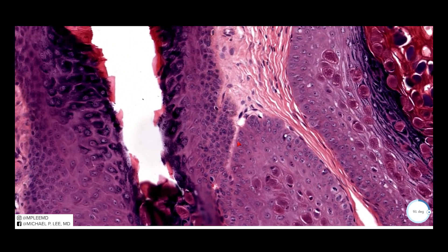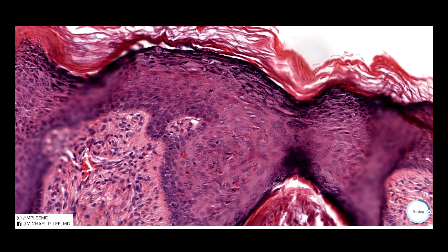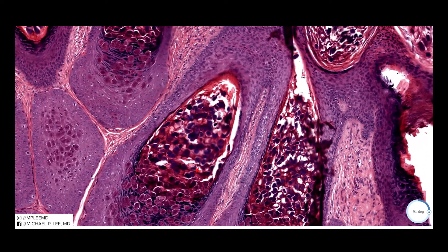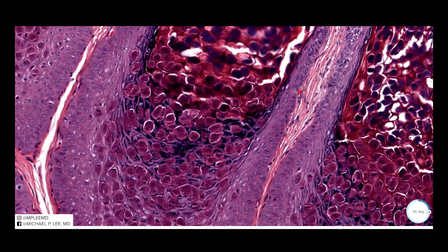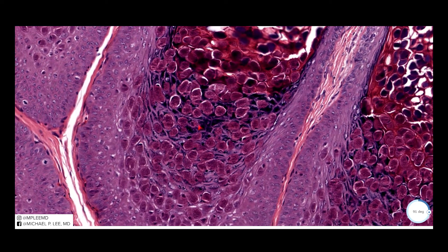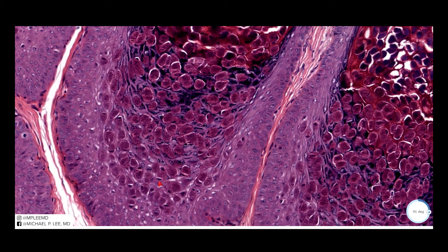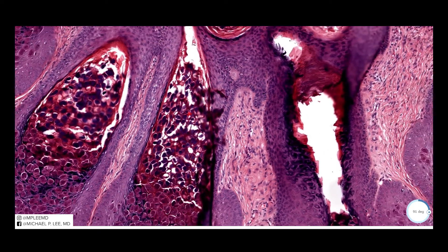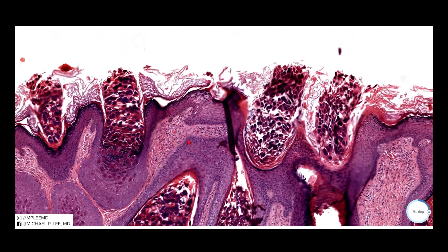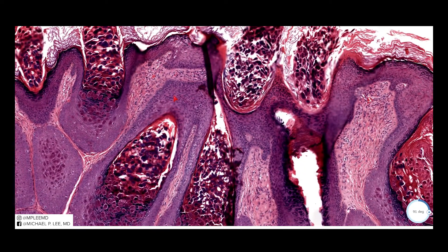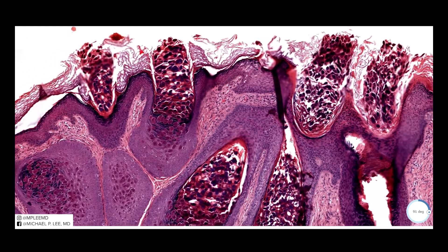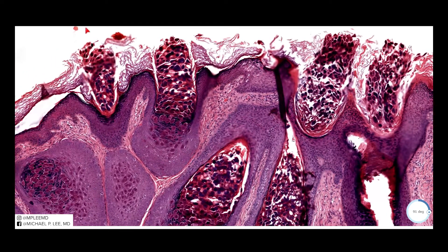These molluscum bodies are very characteristic — they are redder in color than the myrmecia inclusions. You can see here again we have nuclei that are well displaced. The special name for these is Henderson-Patterson bodies, or you can just call them molluscum contagiosum viral bodies. Oftentimes they can sort of flower through the epidermal surface. These are highly contagious, which is why clinically you often see multiple papules.